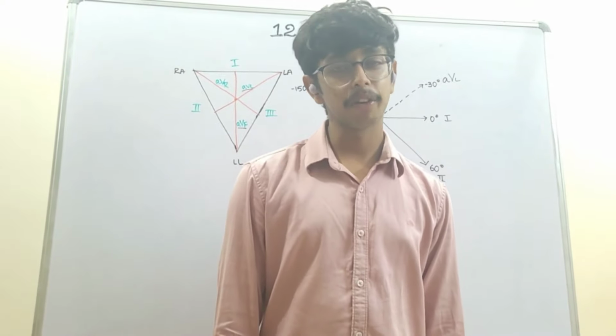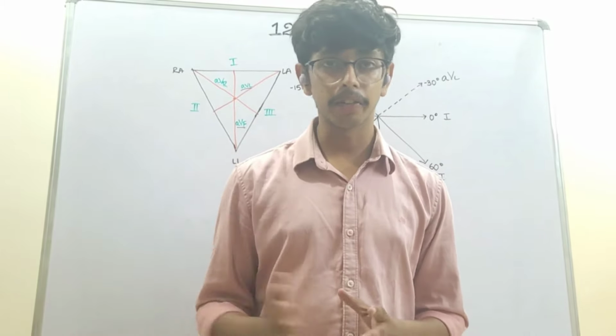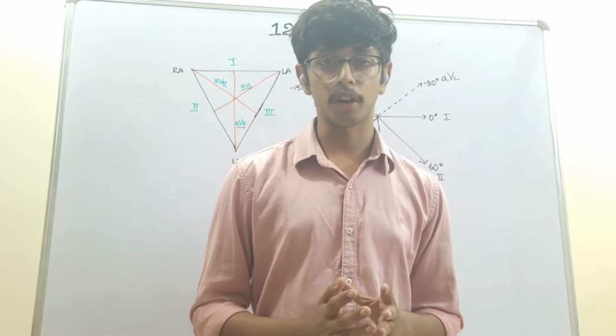Okay guys, now I request everybody to open a normal ECG paper and try to appreciate all the things which we have discussed till now, like the negative waves in the AVR, the higher amplitude waves in lead 2, etc. And I bet you will never forget this in your life.